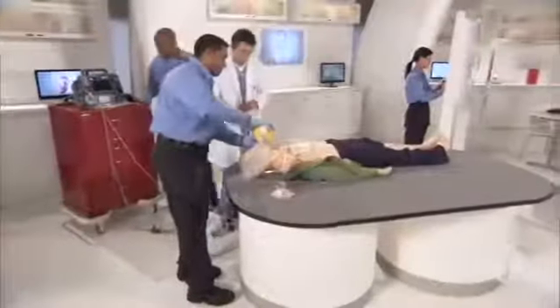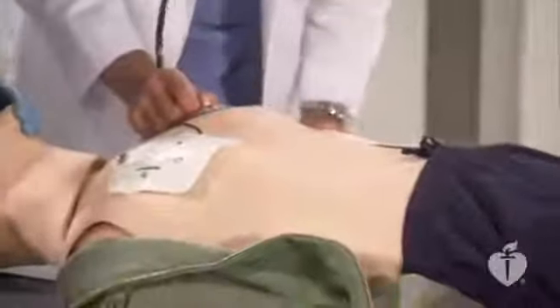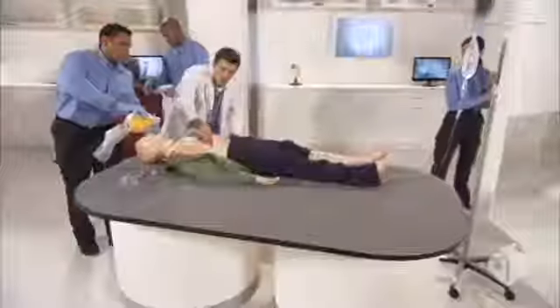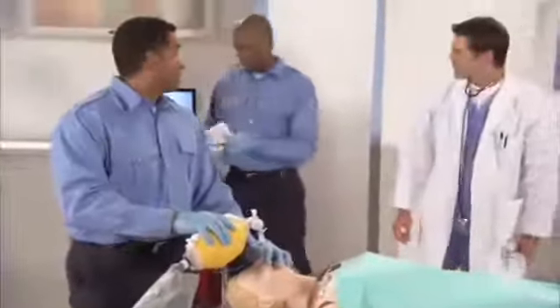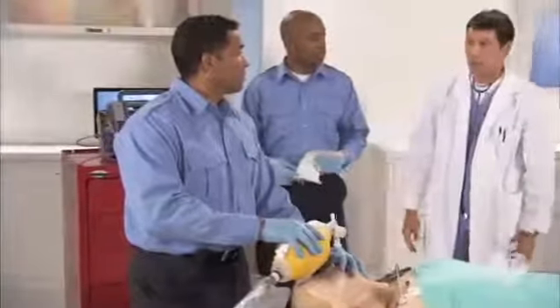Tubes in. Okay, we've got good breath sounds. Let's establish waveform capnography. The O2 saturation is 96%. Here's the 12 lead. Okay, she has a STEMI. Mandel, please call the cath lab and tell them that we have a STEMI patient. PCI and hypothermia can be safely combined after cardiac arrest.